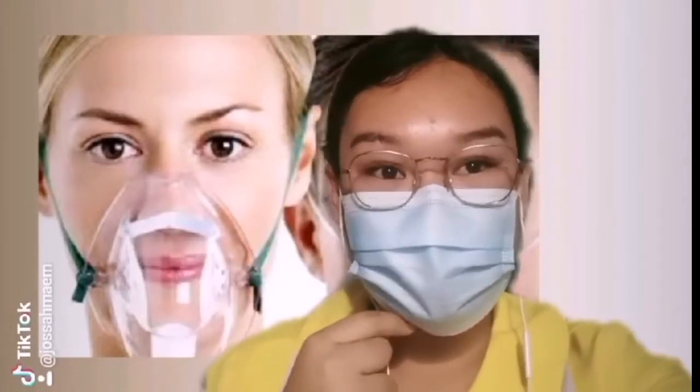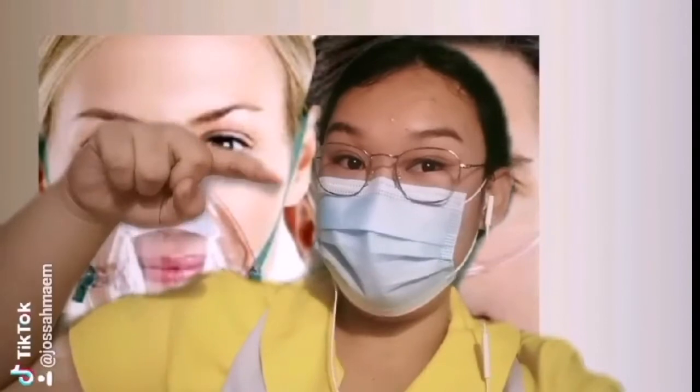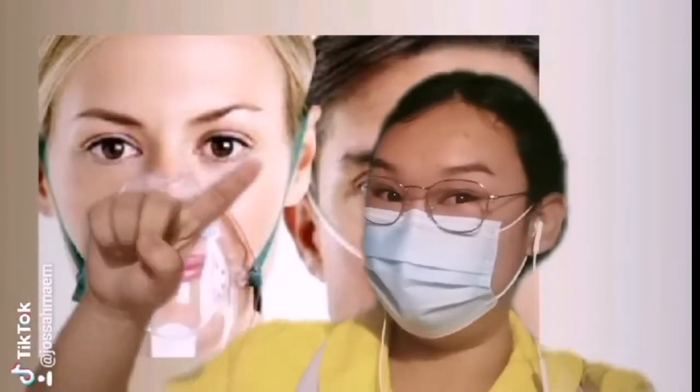Now for the face mask, place the mask over the nose, mouth, and chin. Adjust the strap at the nose bridge. And then place the elastic band around the head. And then you have to stay with the client for a time to observe the response to treatment.